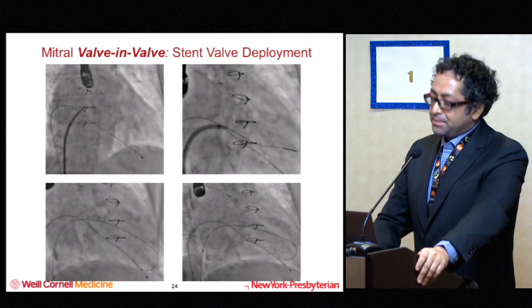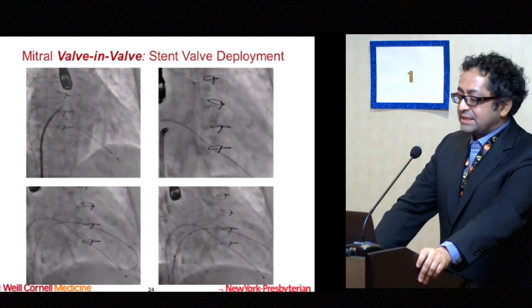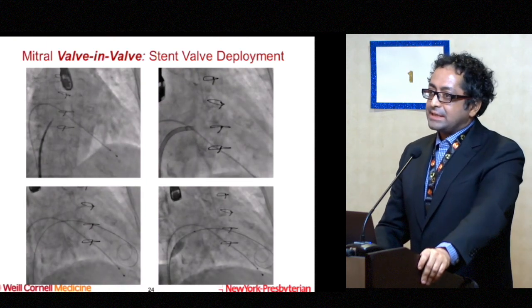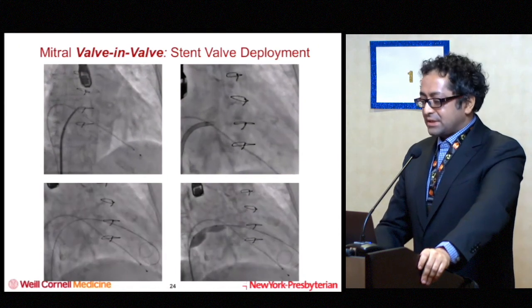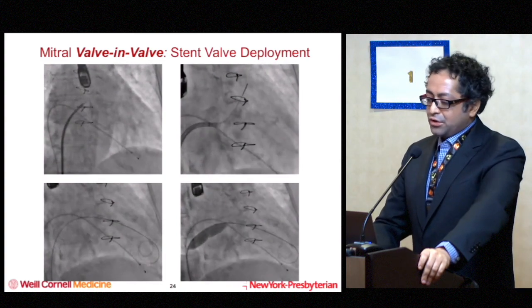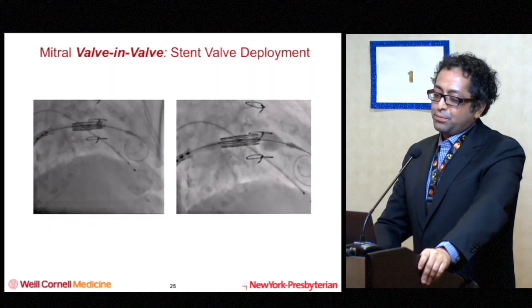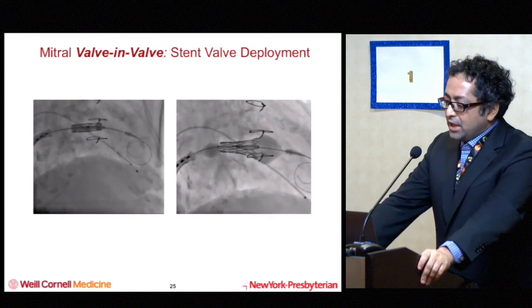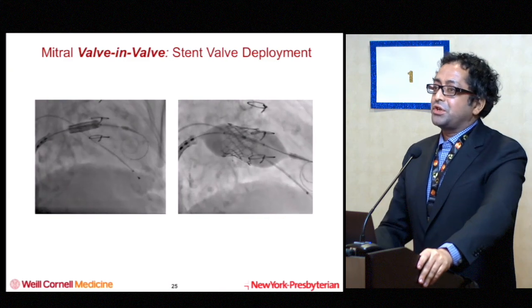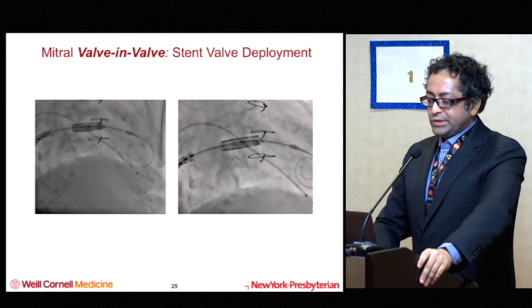Various different wires can be used, with degrees of stiffness. I think we generally tend to use more stiff wires still, but the literature suggests that people are moving away from the stiffer wires for these transeptal mitral valve-in-valve cases, moving to slightly less stiff wires. You do an atrial balloon septostomy, and then you bring the Edwards valve across, you get it into position, and with rapid pacing, make sure you've got good visualization on your echo, lungs down, you inflate, and that's sort of it.